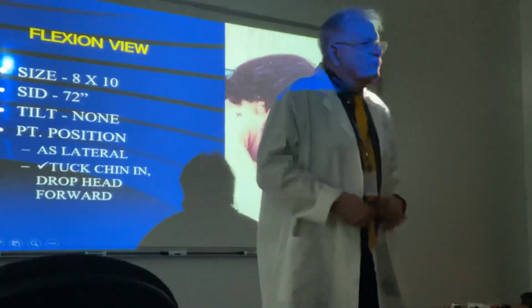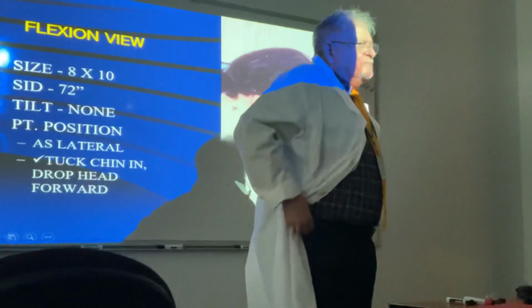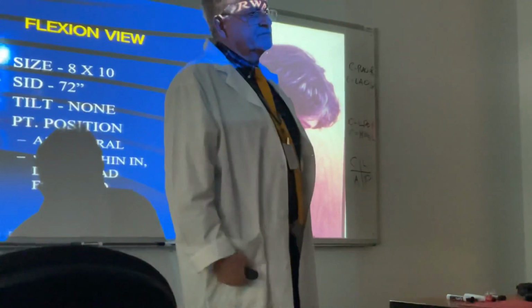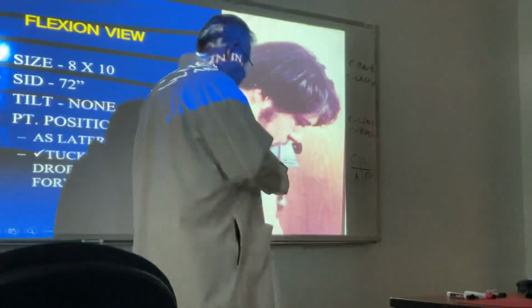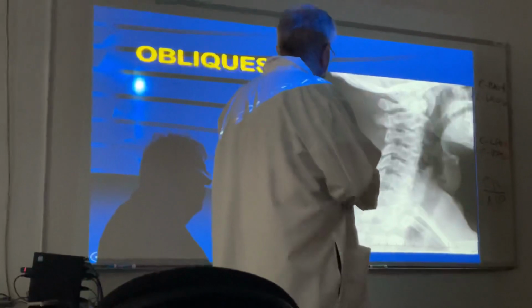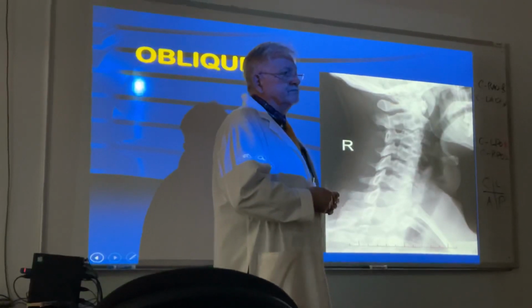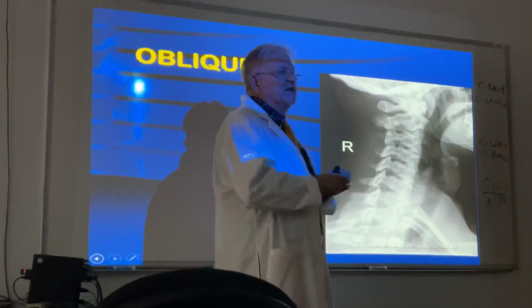I have a really simple question, it's probably stupid. There's no such thing, right? If you put a patient this way against the wall, and the picture's been taken, will the X-ray be reversed? Or will it be essentially this way? Because I'm asking about the oblique shot we have right there. Technically, this looks to me like the left shoulder's against the wall. I don't know with 100% accuracy unless I know.